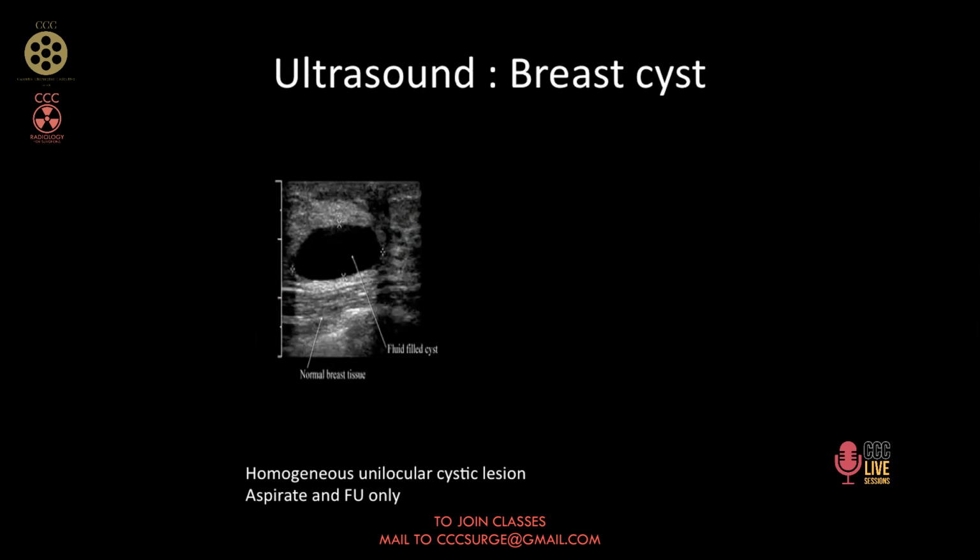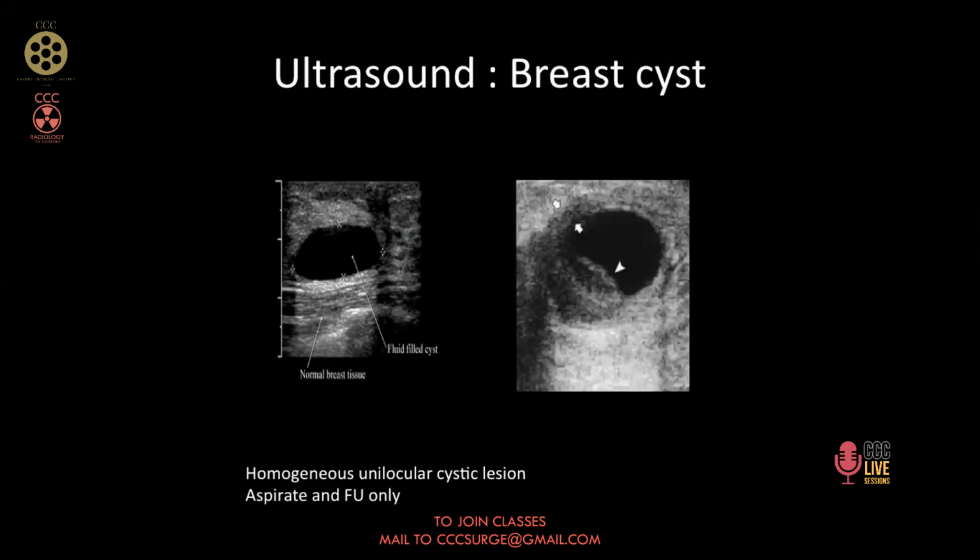You don't need anything. If it's a large lesion, more than 2 centimeter, you can put in a needle and aspirate it. But if it's a small lesion, you can tell the patient, go home, enjoy, come back after 6 weeks. Maybe we will do a repeat ultrasound to find what it is looking like. But look at this lesion. Okay, was there somebody asking me about a cystic degeneration?